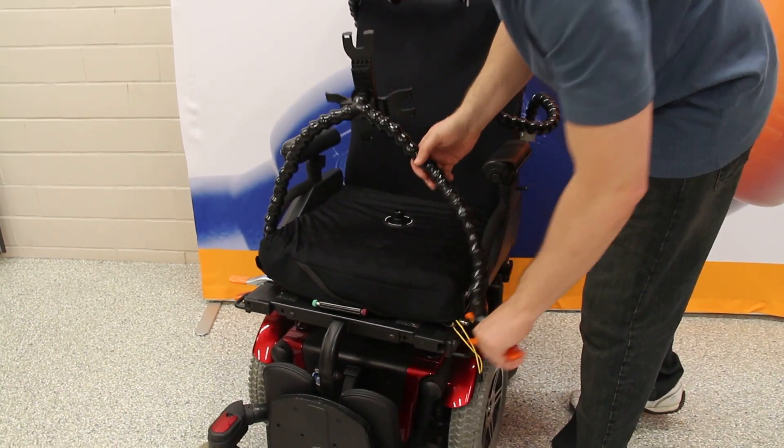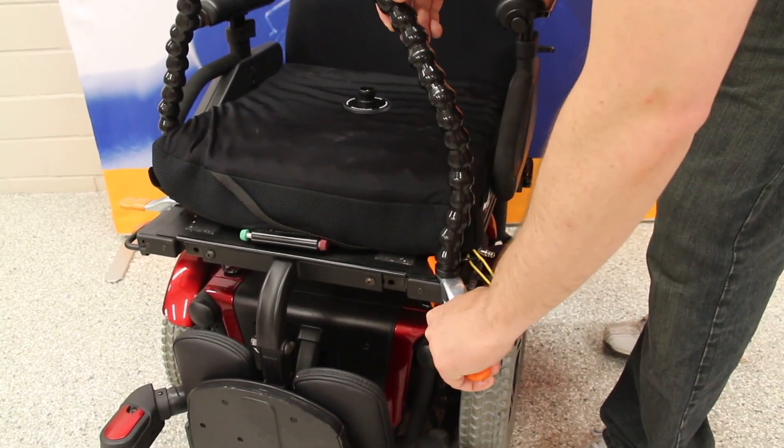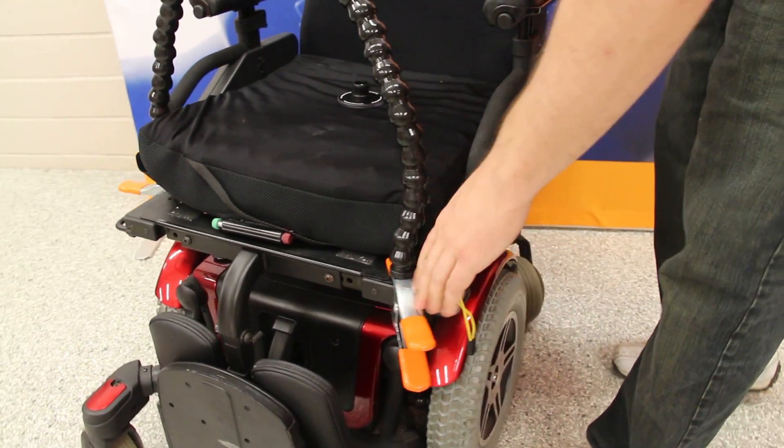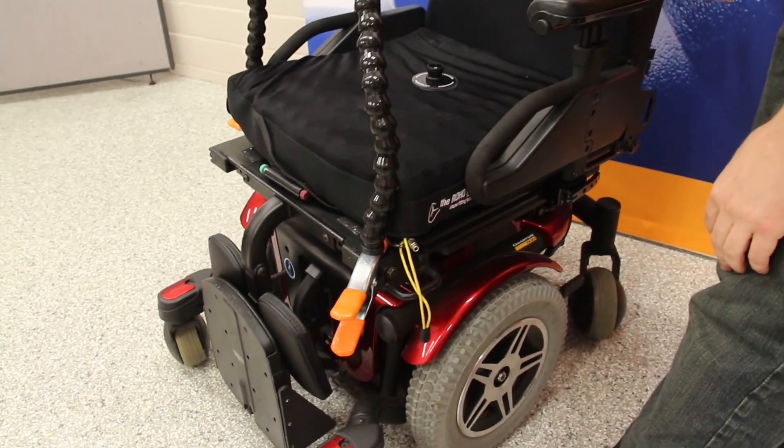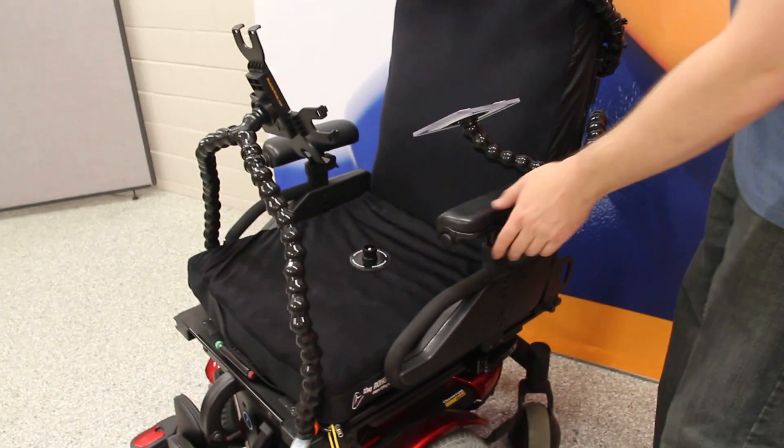To attach the lockline to the chair, in this example, the lockline that comes with this iPad kit comes with two spring clamps, so you want to look for a good flat spot on the chair to mount to. If you don't have a flat spot to attach to, that's okay — we have options for that as well.